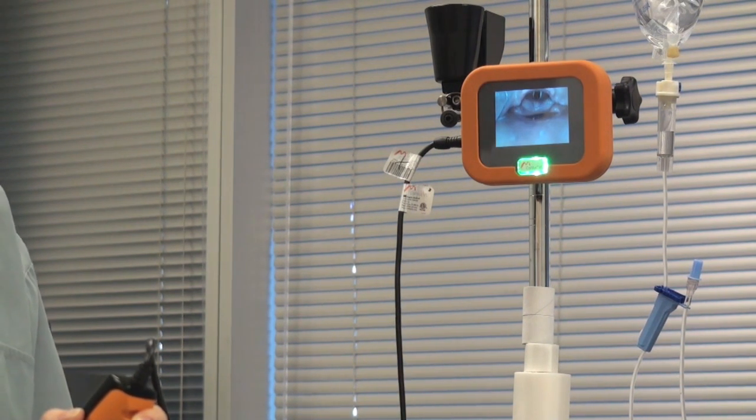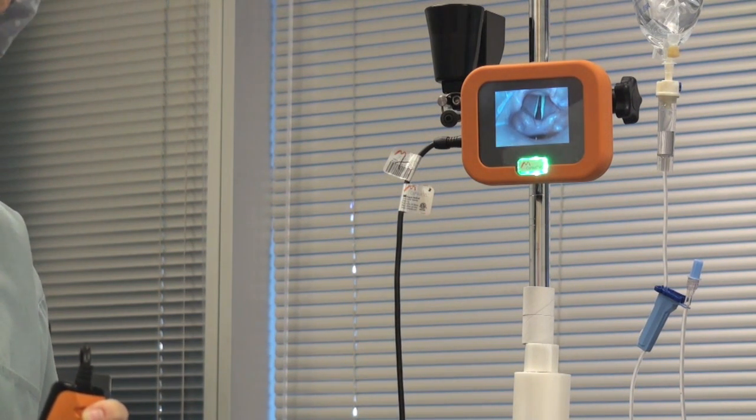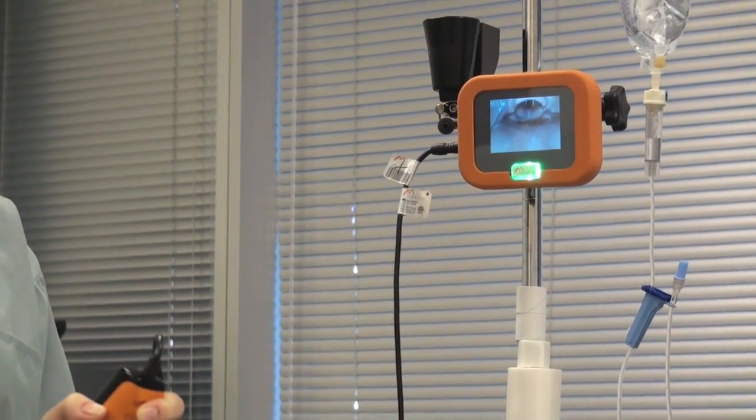You don't want to go down too far with the sheath — that's a common error made by novice BL users. If you're getting a view like this, oftentimes you're displacing the glottis more anteriorly and it can make it more difficult to get the tube to pass. So if you come back like this, you still have a great view of your cords and your arytenoids.